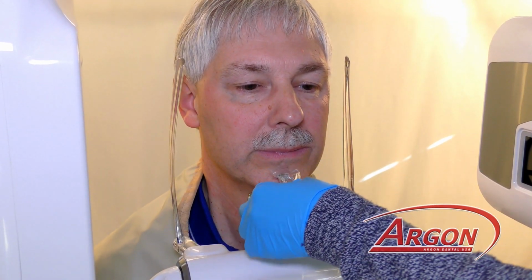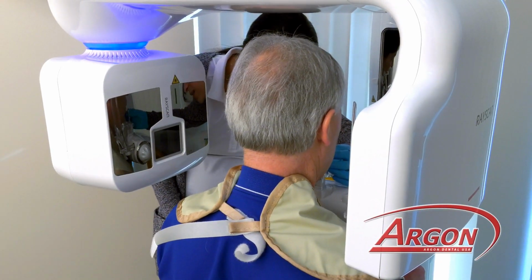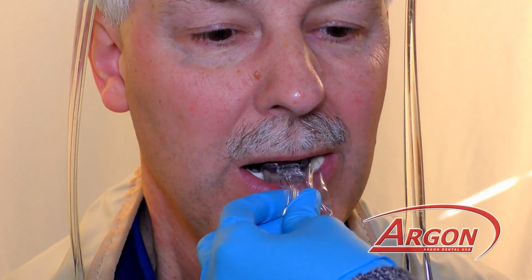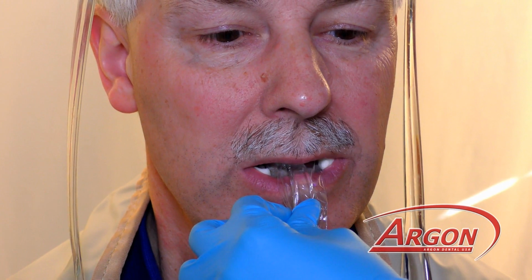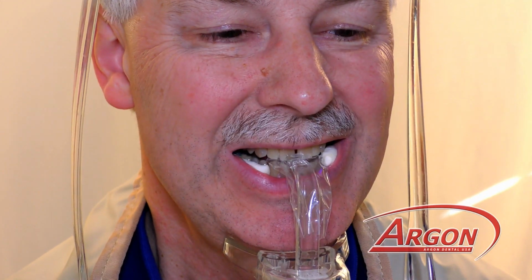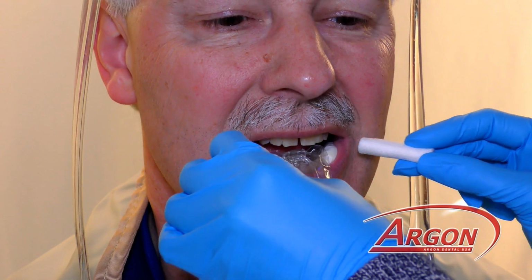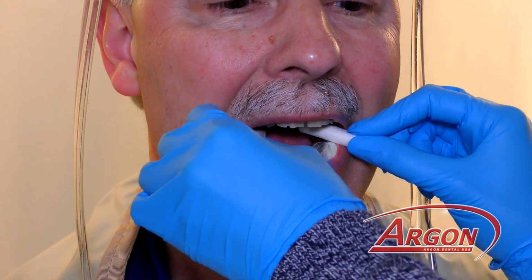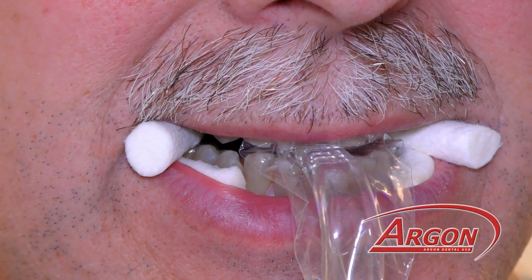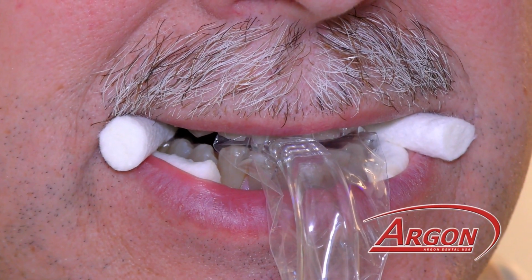Adjusting the CT scanner up and down as the patient has the chin on the chin rest will allow for proper positioning. Using the bite stick, the patient would bite into the bite stick. There is a small V groove on the plastic bite stick that allows numbers 8 and 9 to position into. Two cotton rolls are installed between the arches. Temple stabilizers are used to help position the patient, allowing less movement.